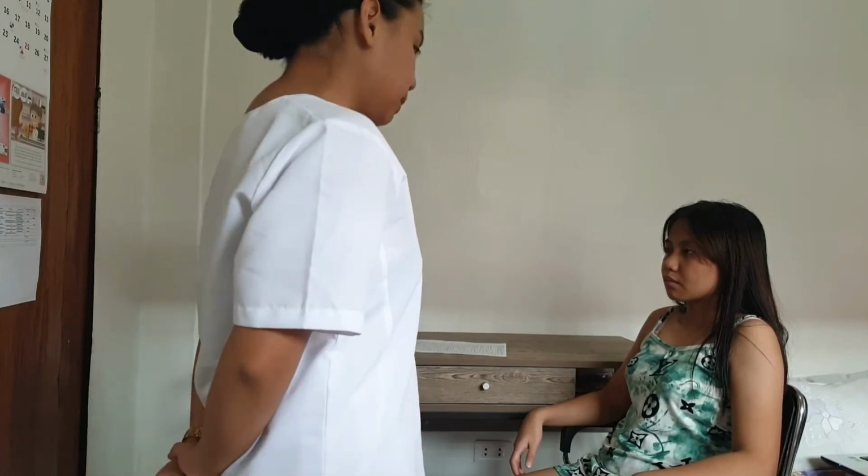I would need my stethoscope to listen to the blood pressure sound. Good morning, ma'am. My name is Raquel Hatulan, a first-year student nurse at Davao Doctors College. I will measure your blood pressure today.